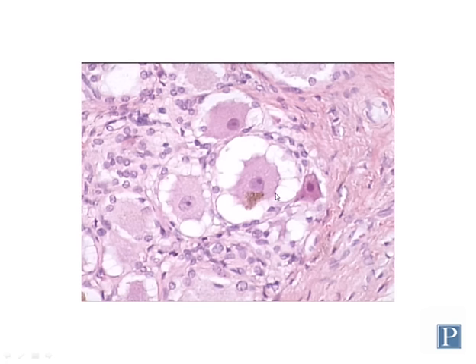Pseudo-unipolar neurons have large cell bodies, as you can see right here. So like the other neurons we've seen, these are quite large. Again, they have a prominent nucleus and nucleolus, and the nuclei of these neurons tend to be located in the center of the cell. They are surrounded by a type of glial cell, which are called satellite cells.